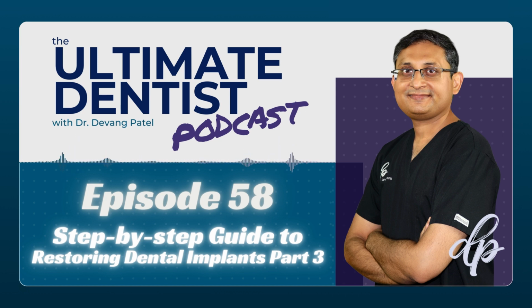Now, if you're using a cement retained restoration, then it is very important that you use a custom abutment. The abutment margin is just equigingival or supragingival on the palatal aspect, and maybe 0.5 millimeters subgingival on the buccal aspect. So removal of the cement is much easier. You get better aesthetic results, and also less chance of peri-implantitis. So make sure that you use a custom abutment if you are going to use a cement retained crown.